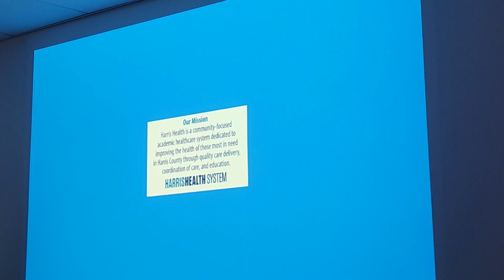If you do see a marker without, for example, initials, or if you see that it's a digital marker, you can use that as a reason to say it's unacceptable, as an error. It can be taken as one of them. So you can say everything's good, the only thing would be this, but it's still acceptable.